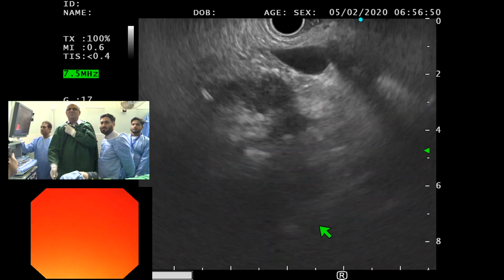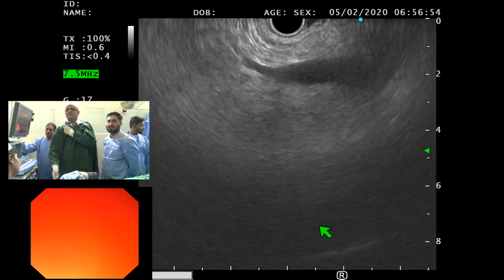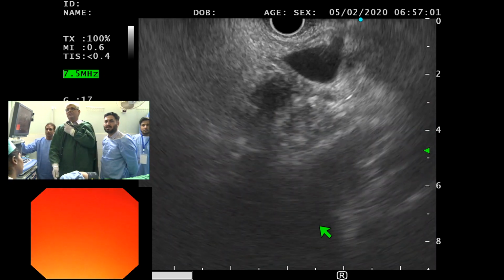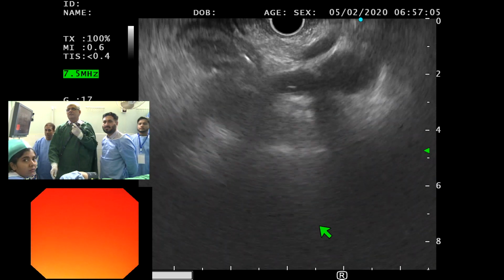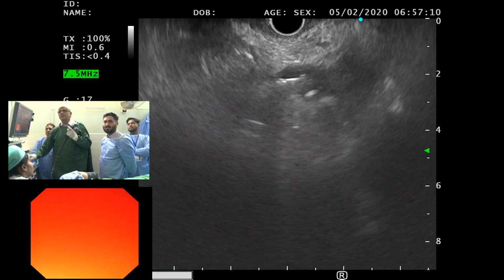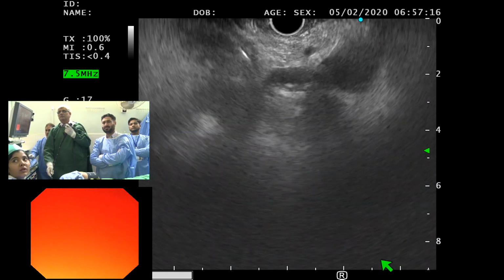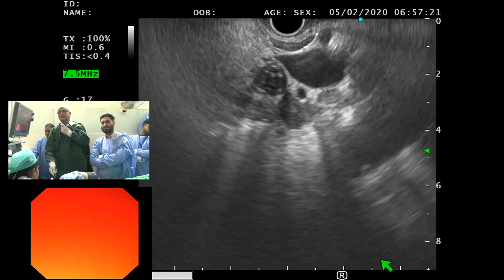This is pancreatic area. This is more, yeah. This is your portal vein, right? This is the portal confluence. Okay. That's your stent. Can you see the stent there? CBD there. There's the stent. You can see the CBD here. Can you appreciate the CBD? Yes. So you can see the CBD there, and hopefully see the stent there in the CBD. It's dilated. Now you can see the stent better.